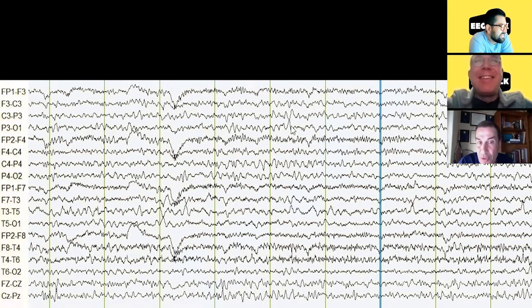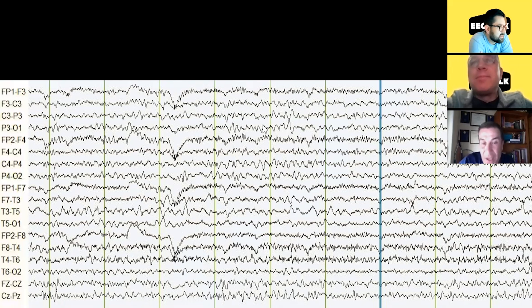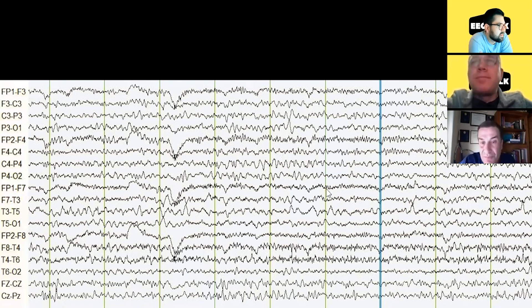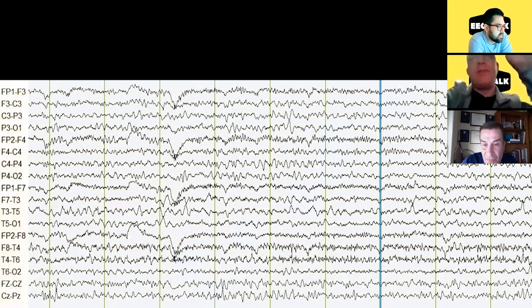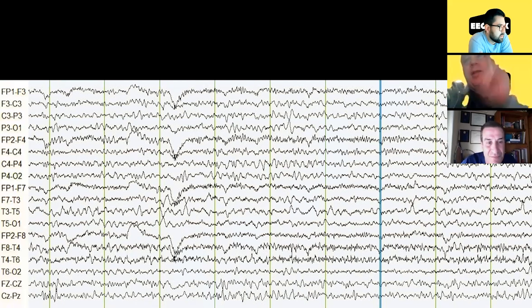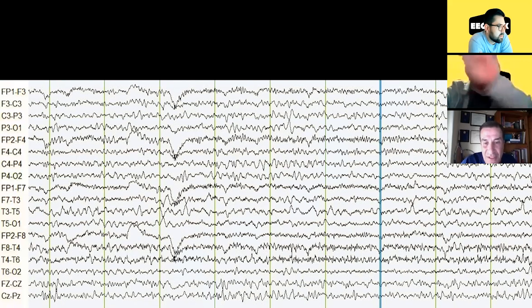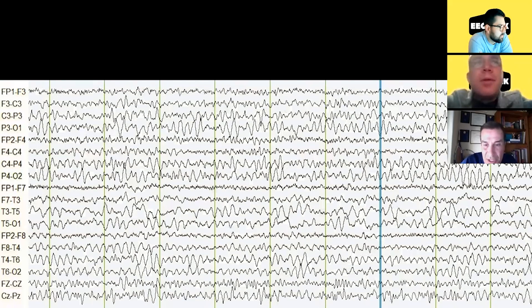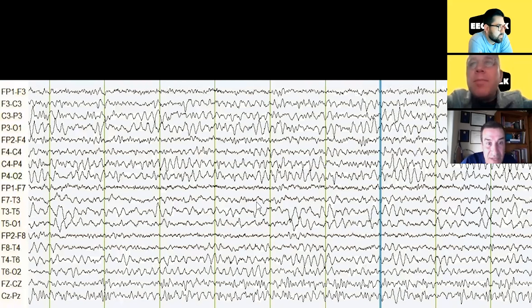The slope is symmetrical and again it doesn't disrupt the background — it's the same frequency as the rhythm before it. It's not an artifact; it has a logical feel. It is cerebral but it's a normal wave. This one is a little bit enveloped — a succession of waves getting bigger, that's the biggest one, and then they go back. Let's see if we find more when the patient gets drowsy — maybe it gets more impressive.